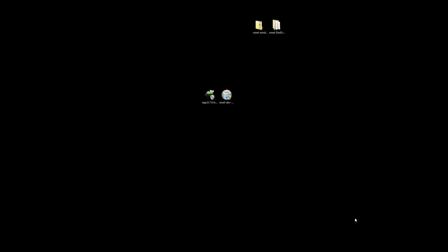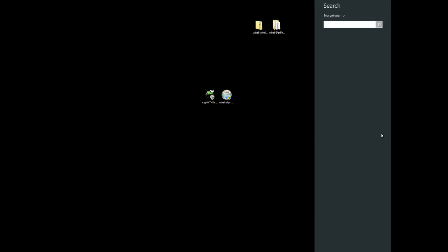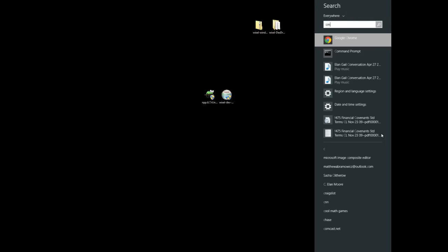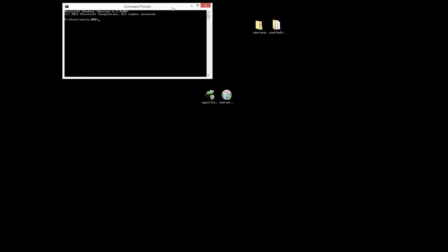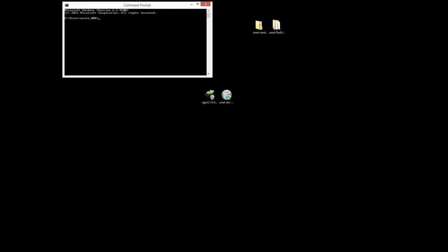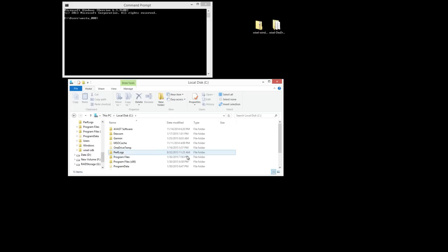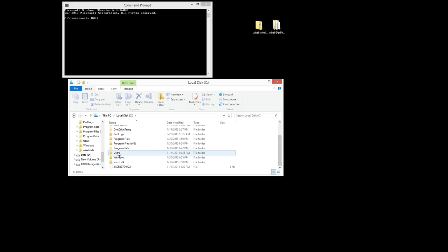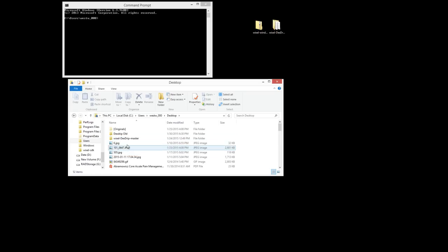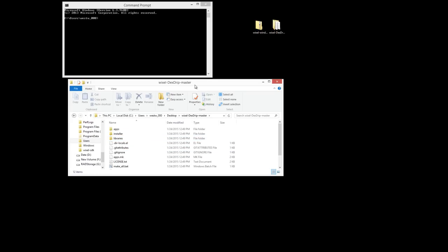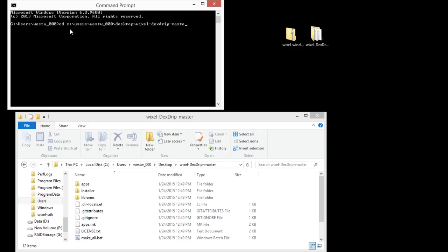So the next thing we want to do is create the Wixel app. So we'll search in Windows 8 for command prompt and open that up. And we'll use the change directory command to point to that folder. So I'm just locating it here so I have my path, and then I'll just use that as my guide when doing the change directory command. And hit enter. That changes the directory. And now we use the make underscore all dot bat. Hit enter.